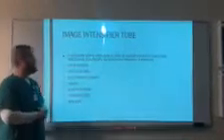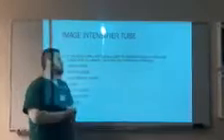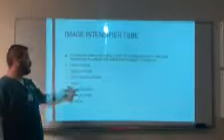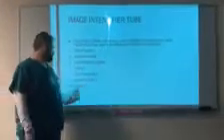The image intensifier tube has many characteristics in how it works. It converts X-rays into visible light at a higher intensity than traditional fluorescent screens through a process, and it goes through the input screen, the photocathode, the electrostatic lenses, the anode, the output screen, the beam splitter, and it goes all the way to the monitor.